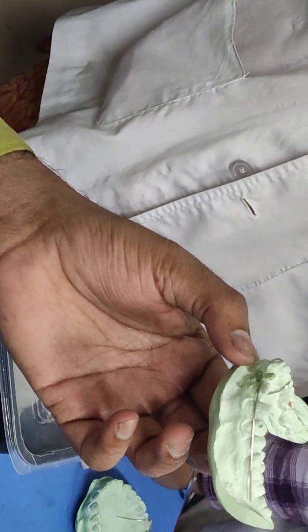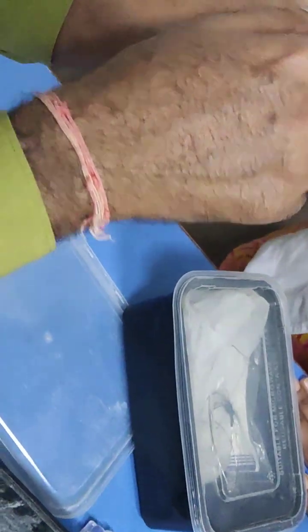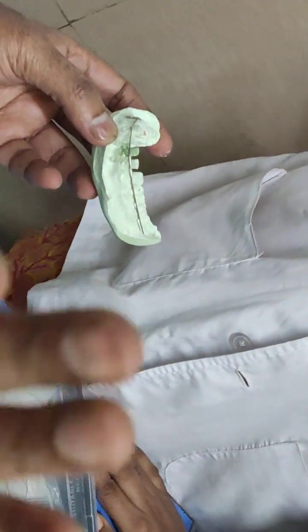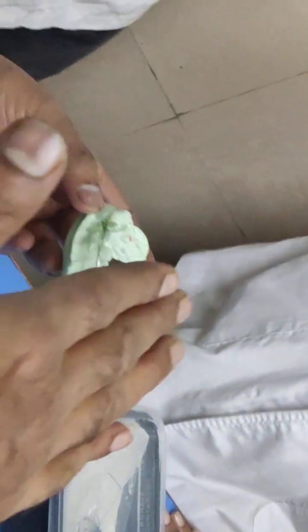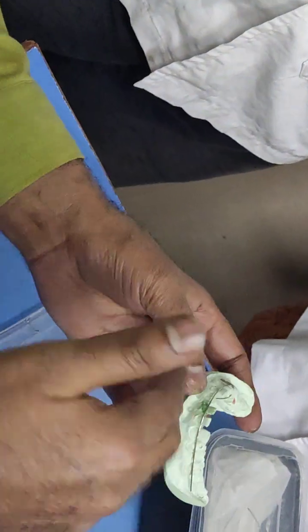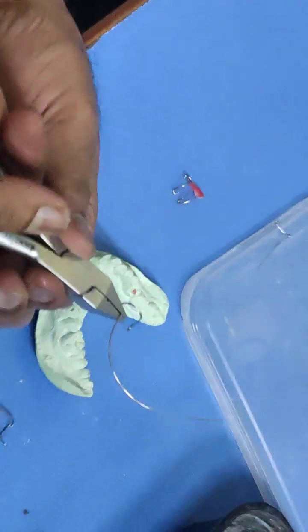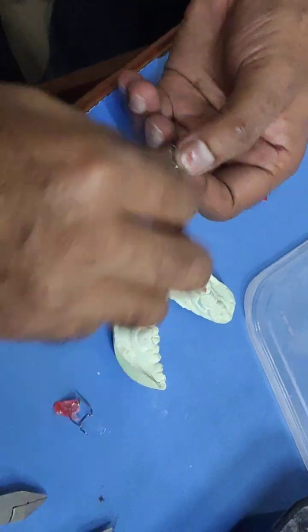Now in that case, just remember there should not be any gross plane change. Okay, suppose here it is lying here, and on the opposite side the wire is lying in the gingival region. That obviously means a problem. Okay, in that case try to make the wire level first, then go to the simple. If there is gingival recession on the opposite side, yes, you hold it firmly. Okay, and just leave it a little bit. Okay, I will lift it up, that will do.